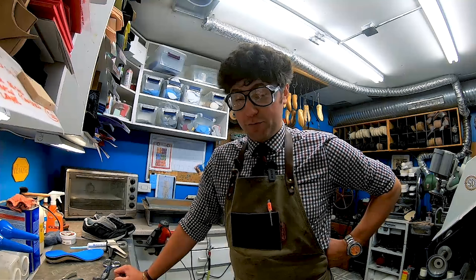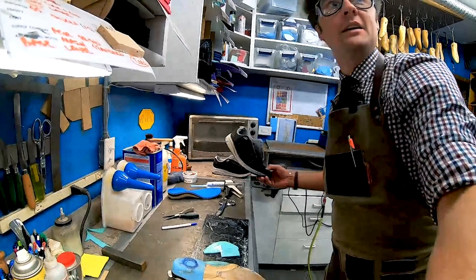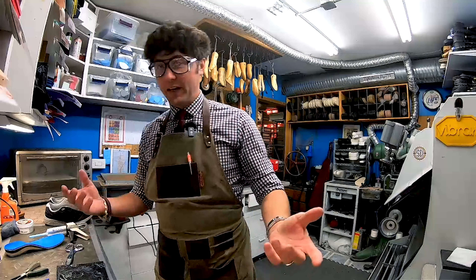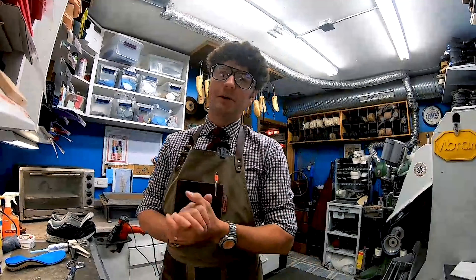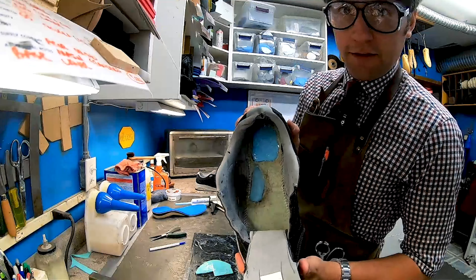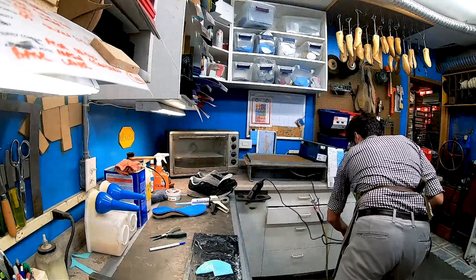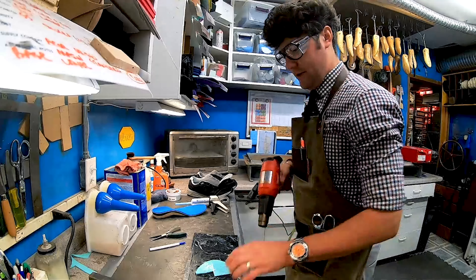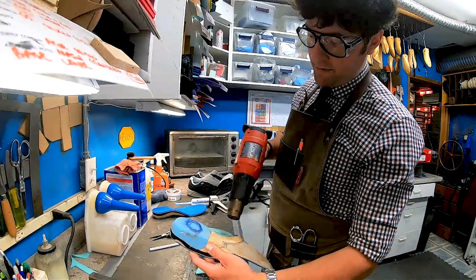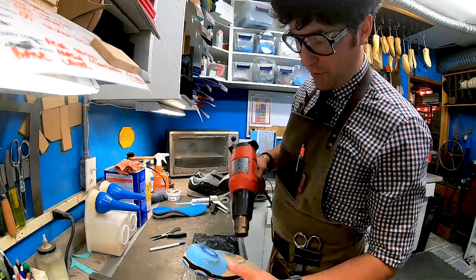There are always shoes and products available. Drew is a great option too — they've got some really nice extra depth products. Saucony, Drew, and Brooks all have some good items as well, so there are always options out there. We're getting close to the end — we've got the drill and fill for the heel ulceration on the right side, a custom orthotic with a number of modifications, and we're filling in this area with a new layer of SR PORON.